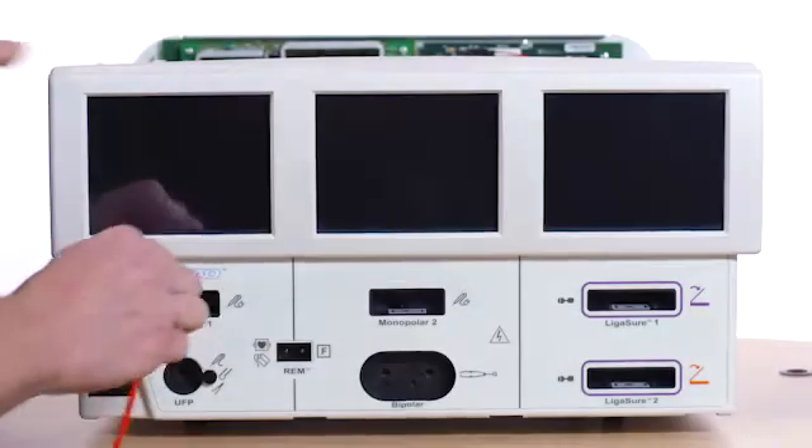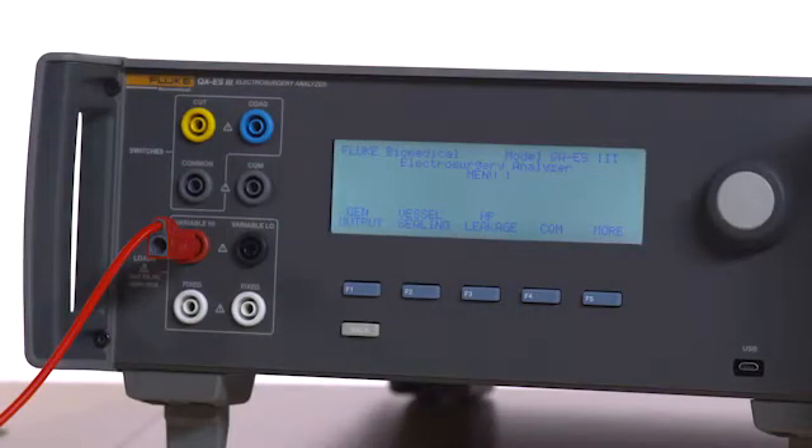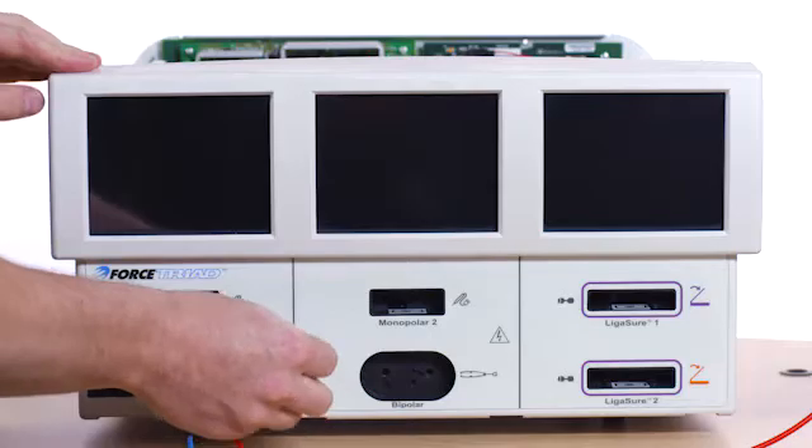Connect a red test lead from the left input jack of the monopolar 1 port to the variable high jack of the QAES-3. Connect the ESU dispersive safety lead to the variable low and the REM port on the Forced Triad.